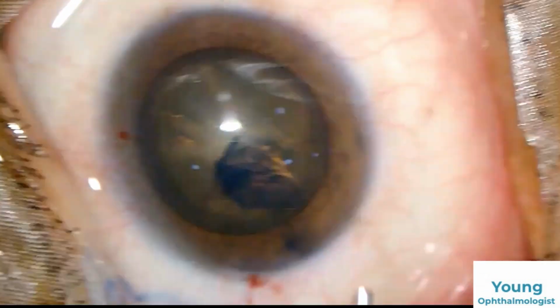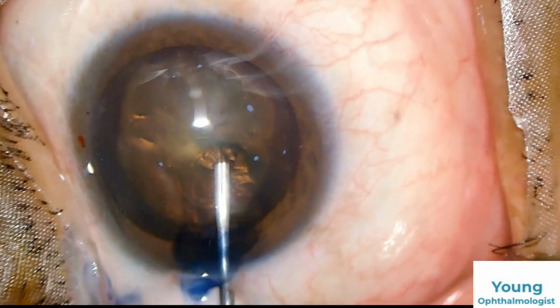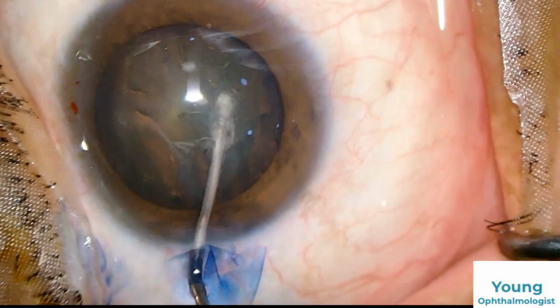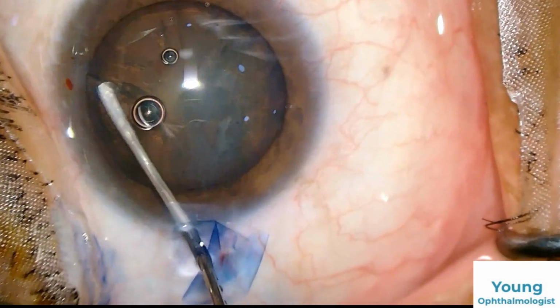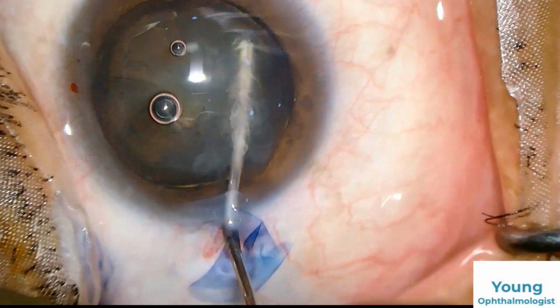Now decompressing the anterior chamber by washing the visco from the anterior chamber. It's time to do hydrodissection. You should always do hydrodissection first, in multiple quadrants, followed by hydrodelineation.